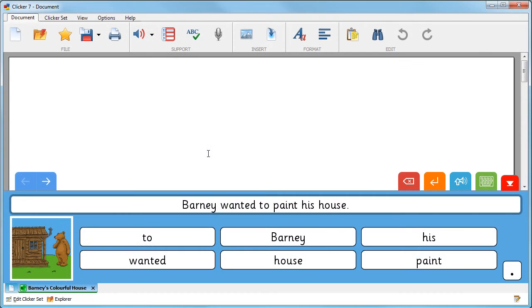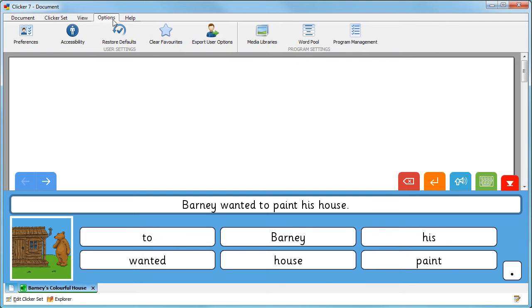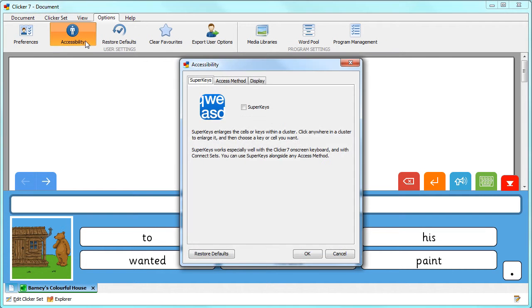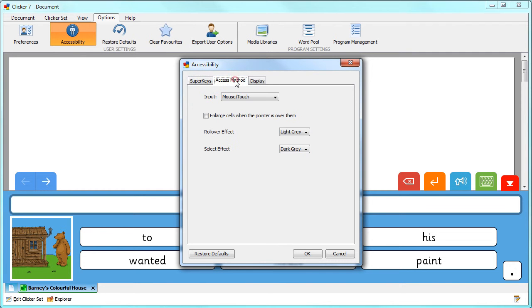The Mouse Dwell features enable EyeGaze users to access Clicker 7. From the Options tab, click Accessibility, then choose the Access Method tab.